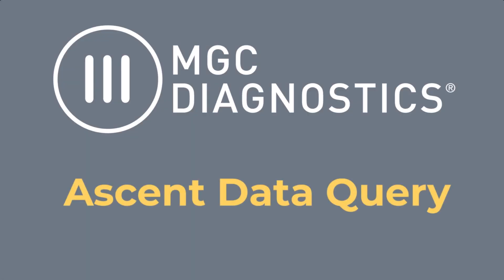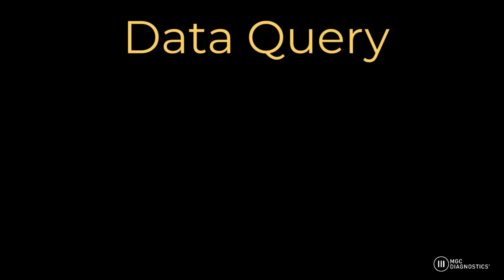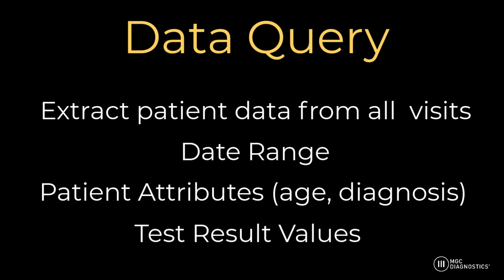In this video, we will discuss how to use the MGC Diagnostics Ascent Data Query software. Data Query is an optional query tool that allows the user to extract data across all patient visits that are stored in the Ascent database. It can be used to find patients or visits based on criteria such as date range, patient attributes such as age or diagnosis, or test result values.